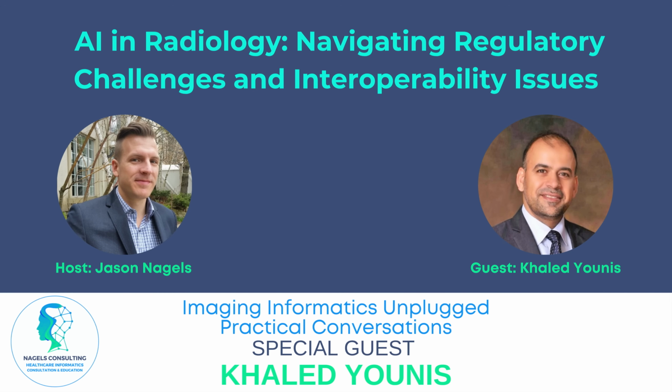And we also looked at diagnostic imaging, radiology, the FHIR, the interactive multimedia reporting. And the goal of that is to encourage the providers to utilize a structured way of representing the AI result.